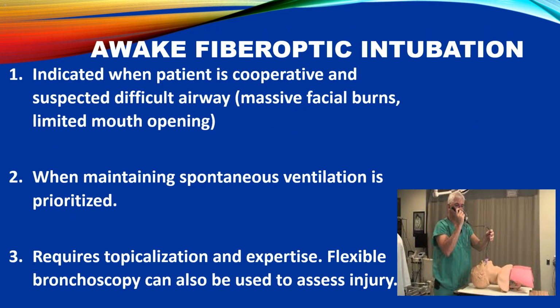Awake fiber optic intubation. 1. Indications. Cooperative patient. Indicated when the patient is cooperative and has a suspected difficult airway. Difficult airway. Massive facial burns or limited mouth opening can make intubation challenging. Maintaining spontaneous ventilation. Prioritizes maintaining spontaneous ventilation, reducing the risk of respiratory compromise.